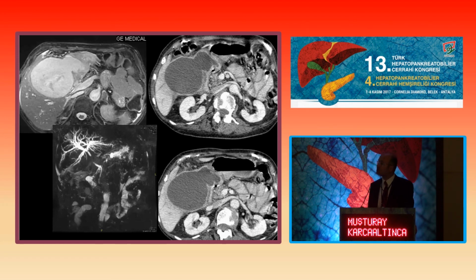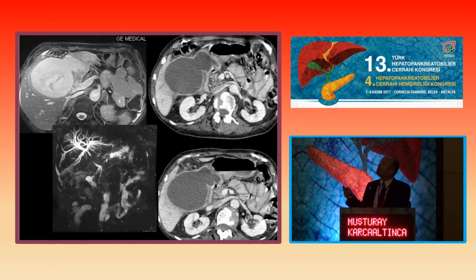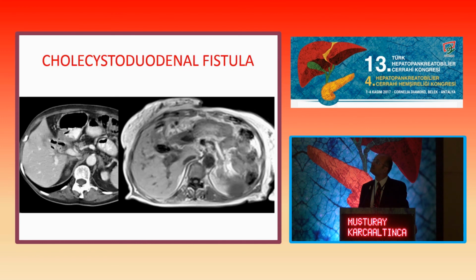And this was a puzzling patient to us. You can see it looks like a tumor, but when we look at the axial images, the patient was not septic actually, but the patient had right upper quadrant pain, and we didn't know really what was going on with this patient. There was a cystic structure, and the patient came 1 day later. We called back the patient after imaging, and the next day appearance was this one. Does anyone have a diagnosis?